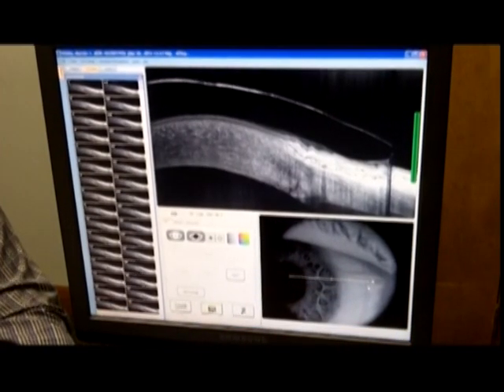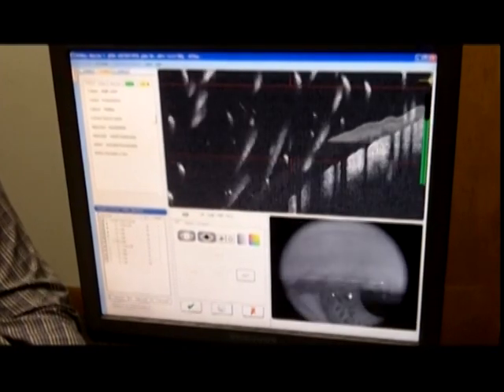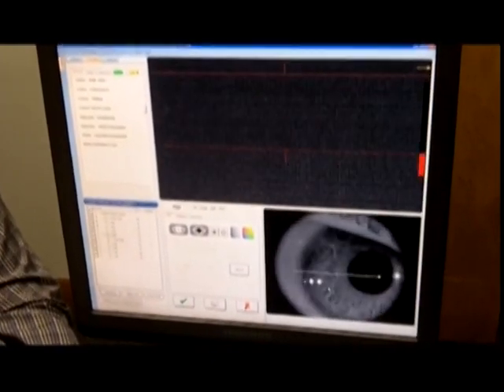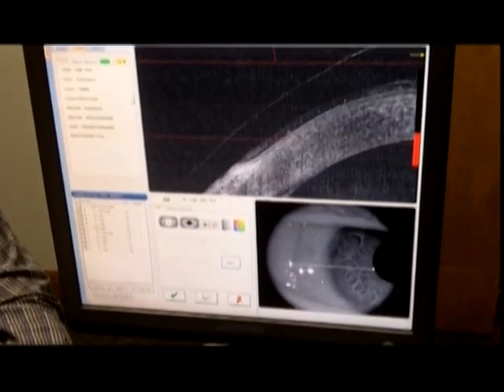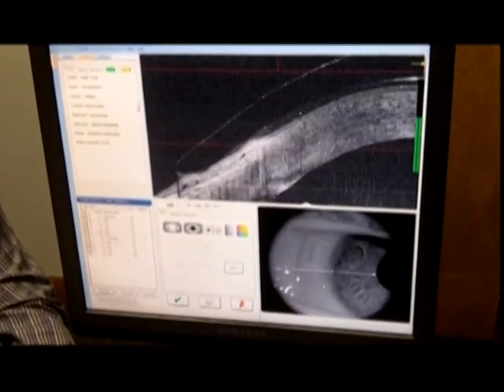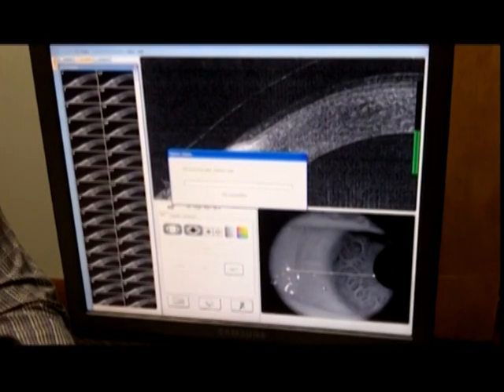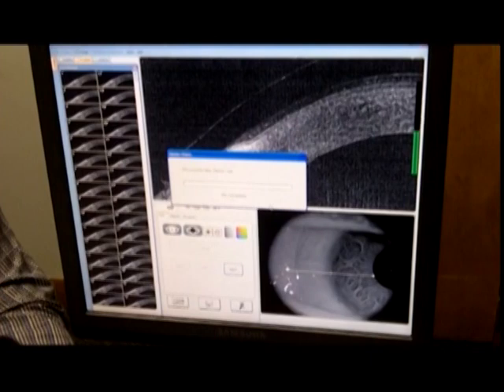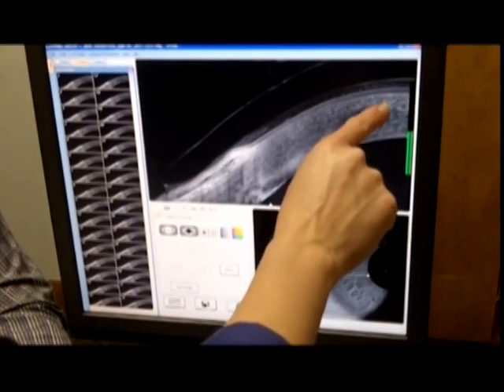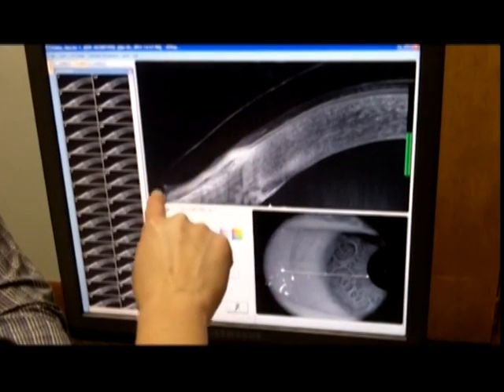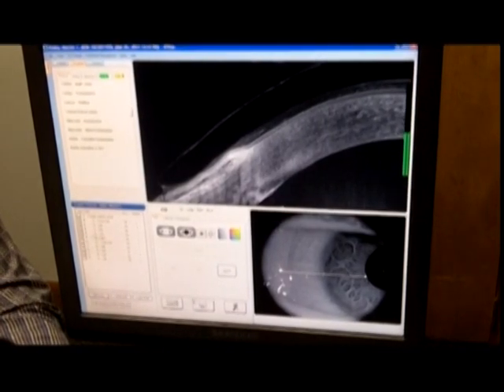I'm going to save that and go to the last image for this eye — a temporal scan. I'm having him look to his left. Not so much — look up a tiny bit. A lot of the patients I do this on have learned what a smidgen is. We want tiny movements, and once we've done the scans a few times we get them trained a little bit better. It's going to process the image and we're going to evaluate to make sure it has all the parts Dr. Wilcox needs to evaluate the lens — we can see the side, the edge of the lens, and a little bit of the sclera. Save it. Of course we would do the same thing for the left eye as we just did for the right eye.